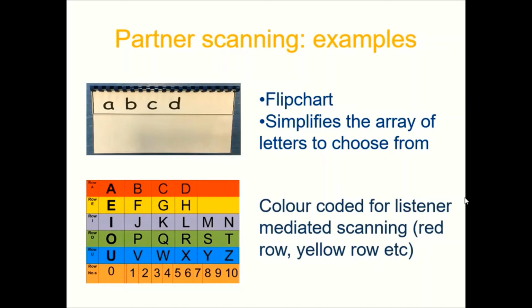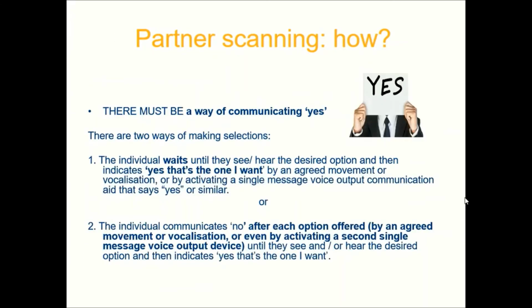It's really hard to keep track of it in your head. Please don't try and do it. Maybe once you're really, really experienced, you can. I still have to make sure I have a pad of paper with me. Write down the letter L, and then you say, okay, second letter. Is it in row A, row E? And you repeat the process, and you keep going until they've completed their message. So that is basically how it works.